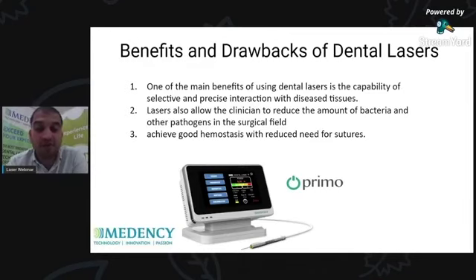For me, I would say one of the drawbacks is the high pricing of lasers. But recently, in the last 2 years, the laser is spreading very well, and the education of laser is spreading very well. And this makes the laser a very good device for the clinic, and worth paying for, as it is a new treatment modality for the patient, and the patient understands that this device makes a better treatment and can be affordable for him.